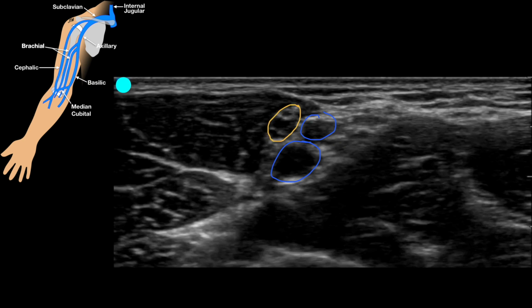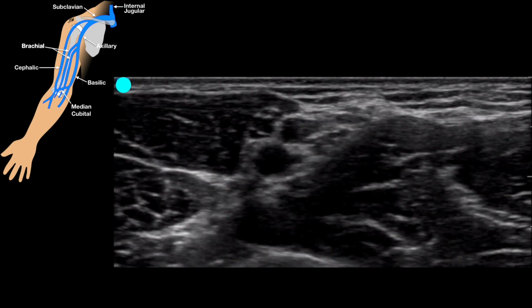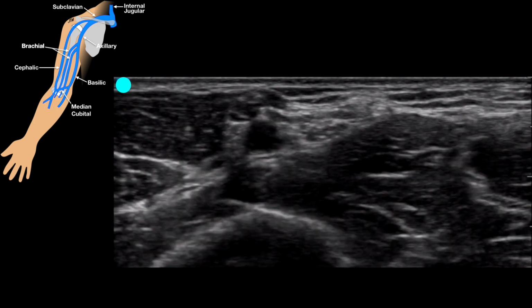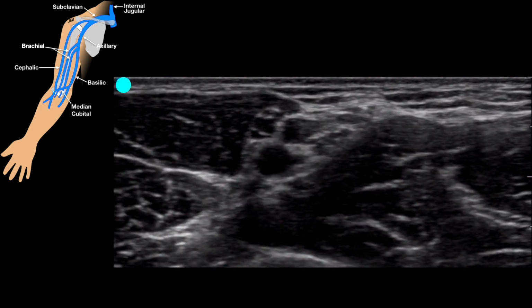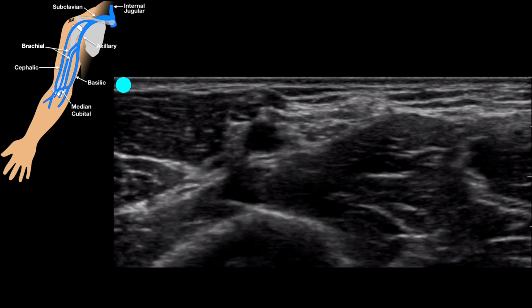This is a big one, and then we should have a little nerve right there, and there's probably one in this spot, but it's hard to see on this image at least. So let's see, that vein's going to be nice and collapsible, and that's what we're going to go after in this patient. Now we have to be very careful because it's sitting right next to their artery and their nerves, and this is why it becomes especially important to know where your needle tip is.